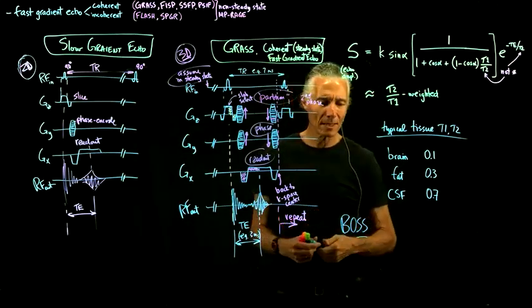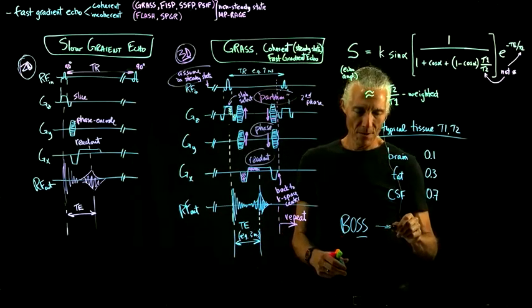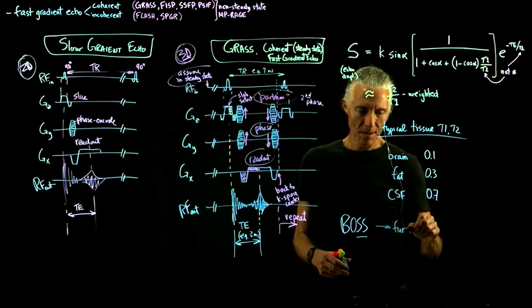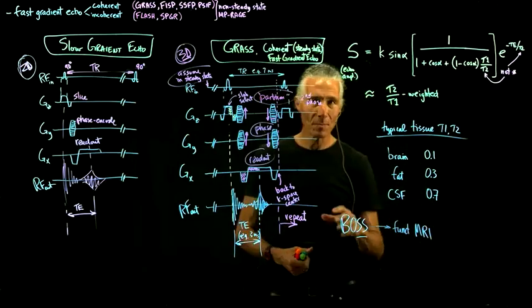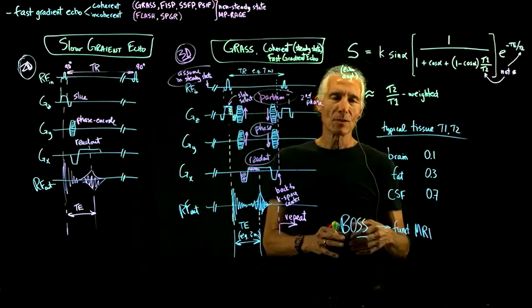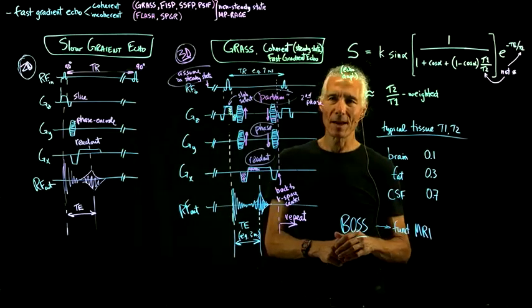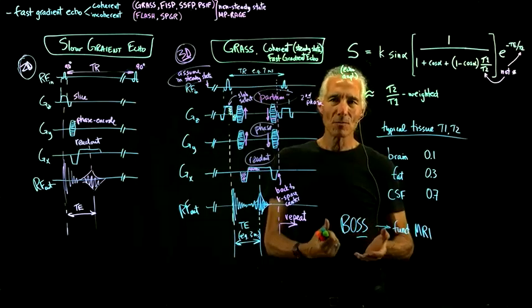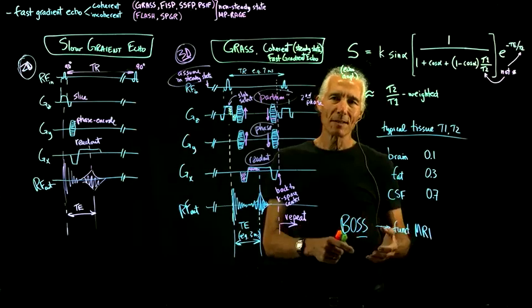It's also been attempted to be used for functional MRI. It doesn't work that well yet, but there's a subfield of people trying to use this to do functional MRI imaging as well. So just be aware of that. And this is in comparison to regular functional MRI, where we don't try to save the signal.